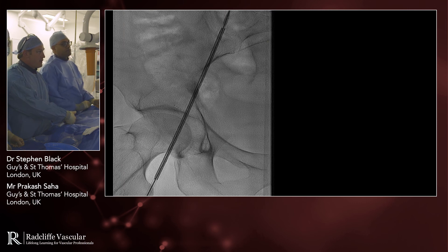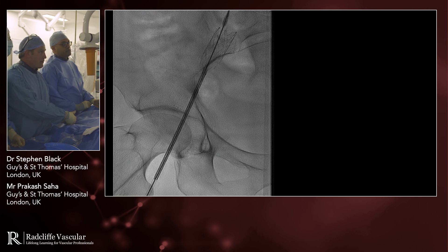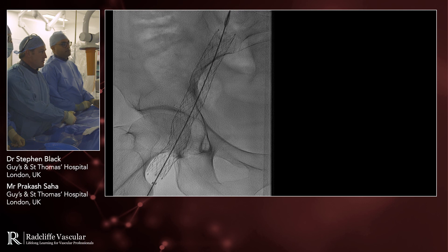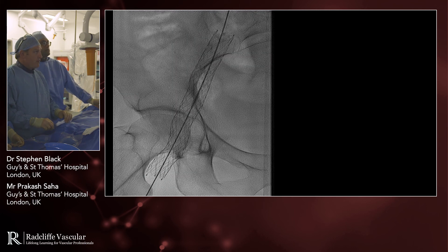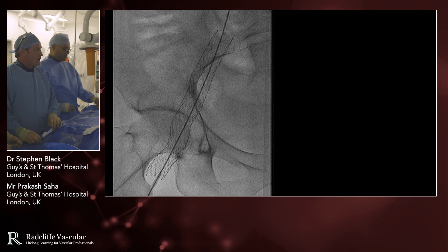As you start the deployment, the stents have a tendency to want to jump forward a little bit, so the important thing is to watch the back marker, which has been pretty stable on this one. That's opened up quite nicely there. We'll go and check the top end, but we're going to take another stent to take this around the bend into the common iliac vein.